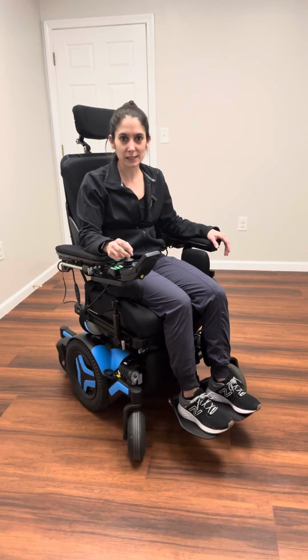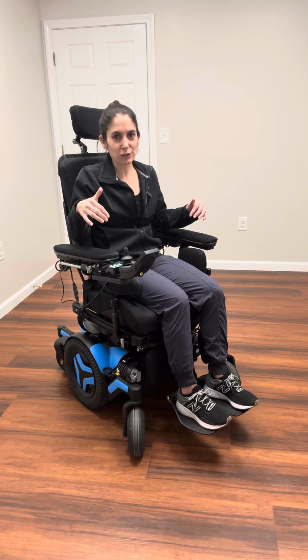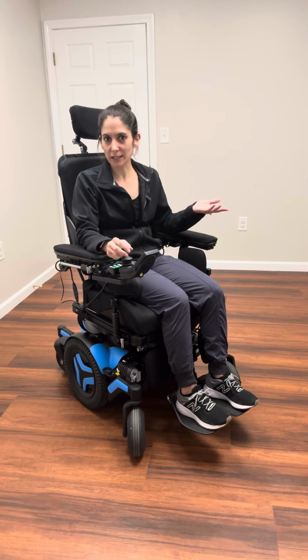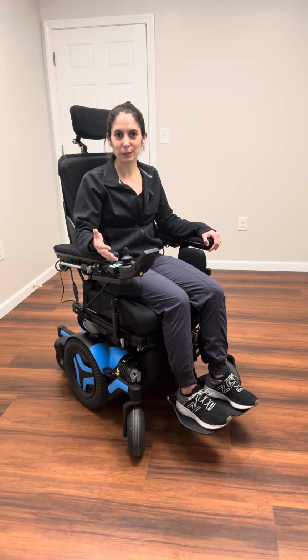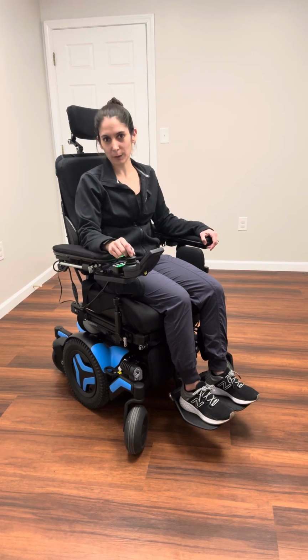In some houses, just the way that they're set up, some people do need that mid-wheel drive chair so they have the smallest turning radius, but some people do need the chair that is the best at navigating those 90-degree turns. You shouldn't be by yourself in making this decision. Like I said, this is a conversation to have with your therapist and ATP, and a decision that shouldn't be rushed because it's an important one.